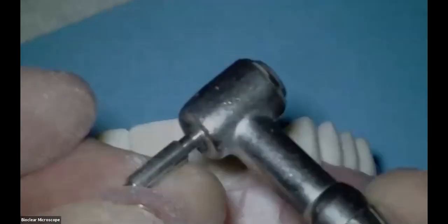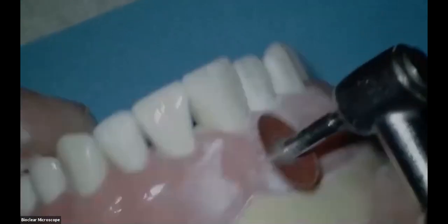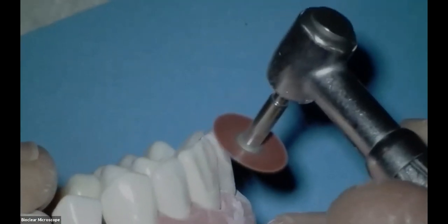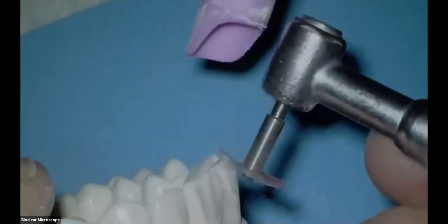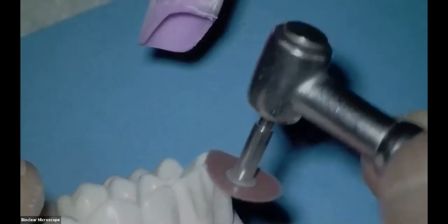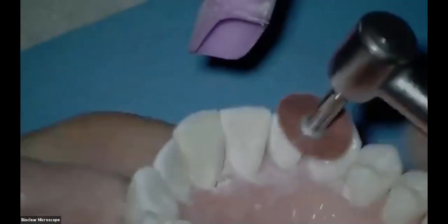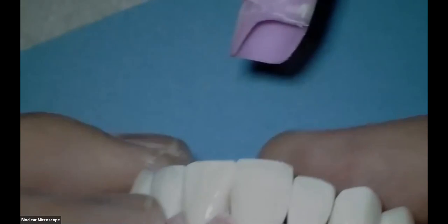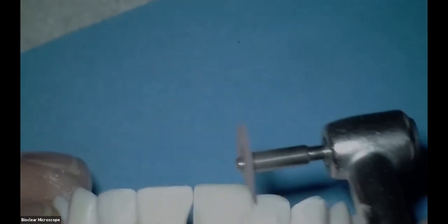Then I like to come in and do a 45-degree bevel. Now, Disha, this is kind of new. This keeps us from violating the neutral space. I'm going to roll this in at 45 degrees here and 45 degrees on the palatal. And that's my general shape.